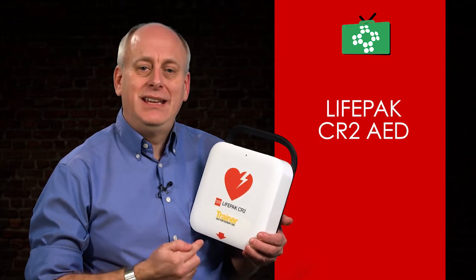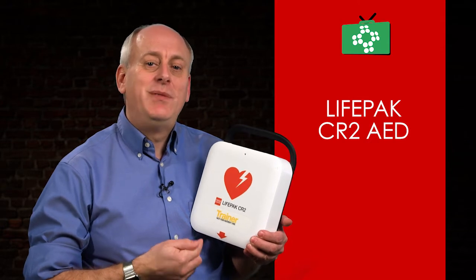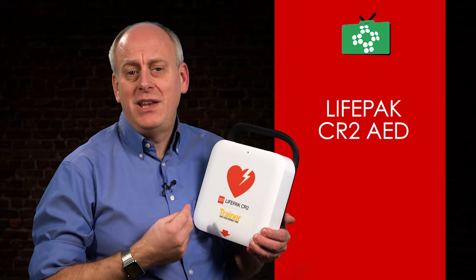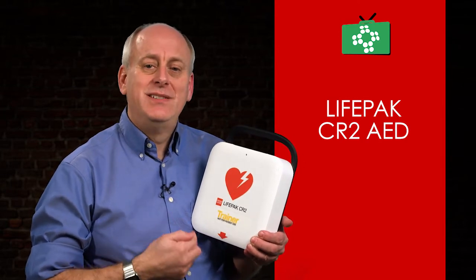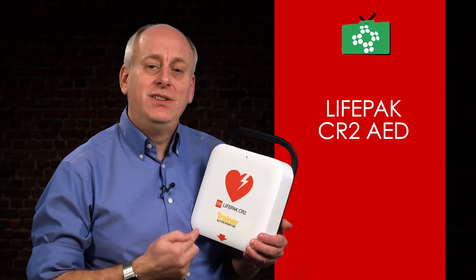The data from the use of the AED can also be transmitted to a central point, or to the doctors dealing with the patient when they arrive at the hospital. While you're managing multiple AED units, the CR2 makes maintenance much easier, ensuring that all units are fully functioning and ready to use.